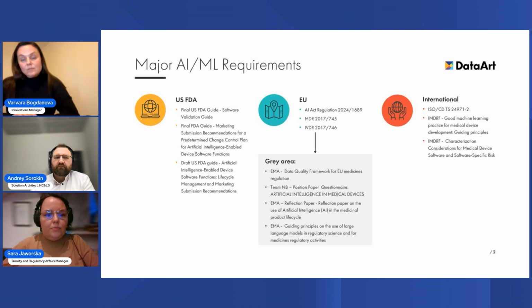So it's very robust and we can use many different sources of requirements, as long as we make sure that those requirements are not contradictory and are best for our case. On top of that, new AI-specific ISO standards are currently in development. We also have the new IMDRF guideline on good machine learning practices. And the latter guideline describes very high-level principles for AI development.